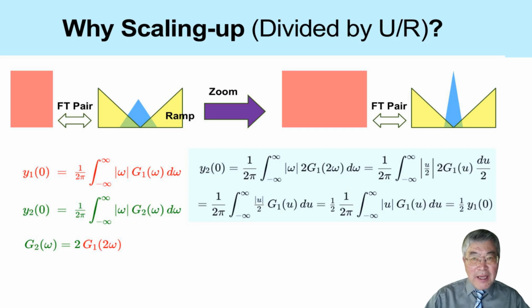Now let us look at the correct way to understand this scaling factor. Instead of looking only at the magnified point object itself, we should look at what happens after filtering. This is important because filtered back projection does not directly back project the raw projection data. It first applies the ramp filter and then performs the back projection. So the point object and the ramp filter must be considered together.